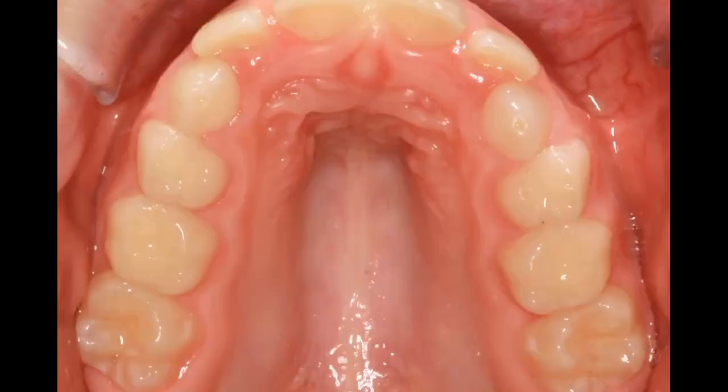Let's look at the arch itself. High vaulted palate. Now, overall, is there a huge crowding concern? I was taught in residency not to do anything on cases like this, minus the crossbite part, right? Yeah, we got to fix that. But as far as the arches go, it was always, hey, just do it later, because teeth will come in fine. So we might have addressed the crossbite with maybe some cross elastics, maybe some braces, maybe a quad helix, maybe something to get the teeth right. But the skeletal concern, at least in my program, wouldn't have been the number one concern here.